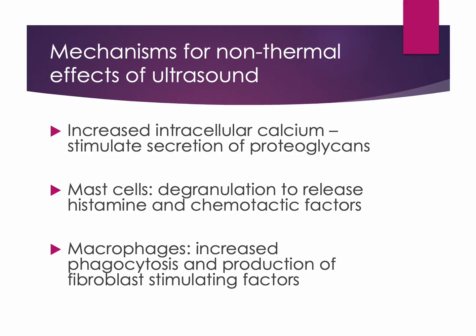healing. The mechanical effects of acoustic streaming and stable cavitation can alter cellular activity and cell membrane permeability, leading to a cascade of physiologic responses involved in tissue repair. One proposed effect is an increase in intracellular calcium within cells. Calcium acts as an important cellular signaling molecule, and increases in intracellular calcium may stimulate the secretion of proteoglycans.